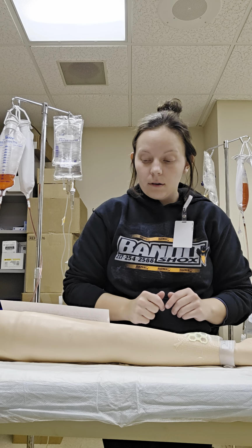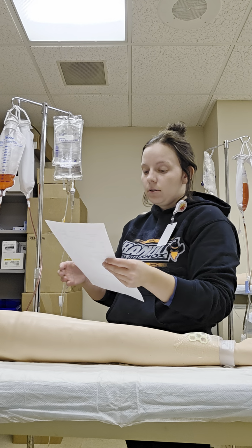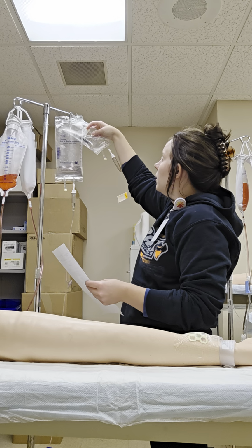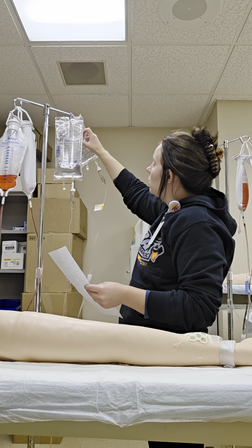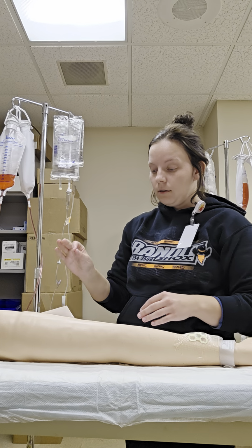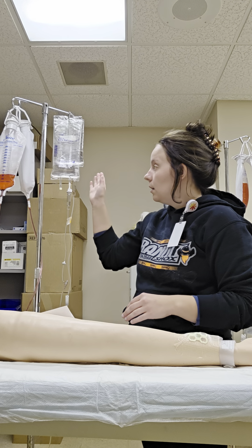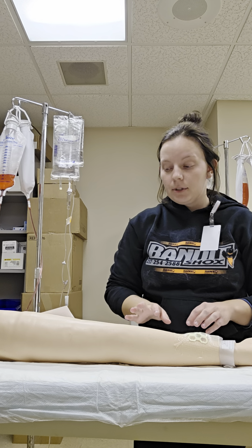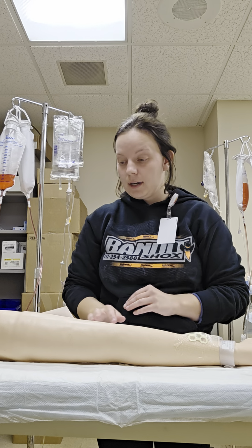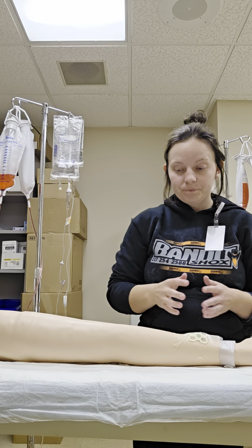So now I'm going to go ahead and do my 5 med checks or med rights. So Mr. Foley's ordered ampicillin or Unasyn, 500 milligrams, and I've got ampicillin or Unasyn 500 milligrams right here. It's going to go through his IV. He's going to receive that at 1900, which is right now. And this is for Ferdinand Foley, and that's who I have right here. So I'm going to go ahead and set my MAR off to the side.